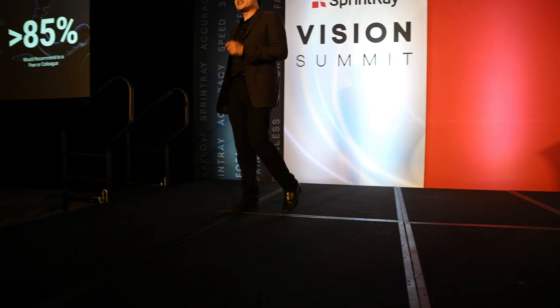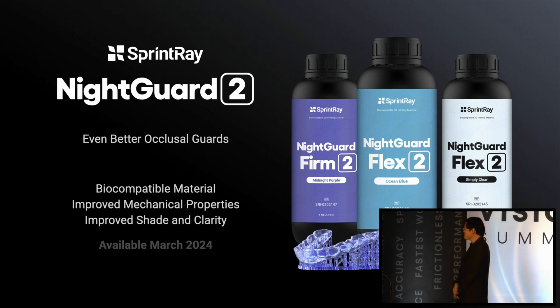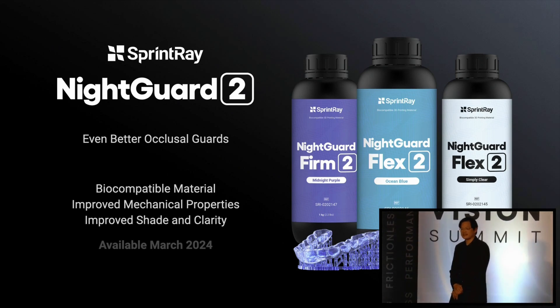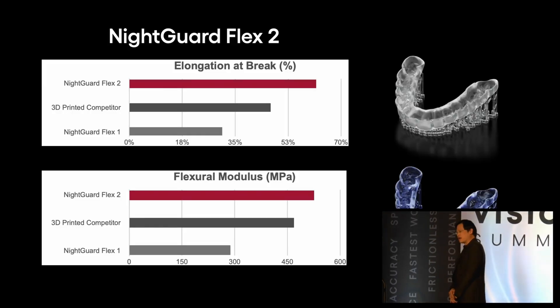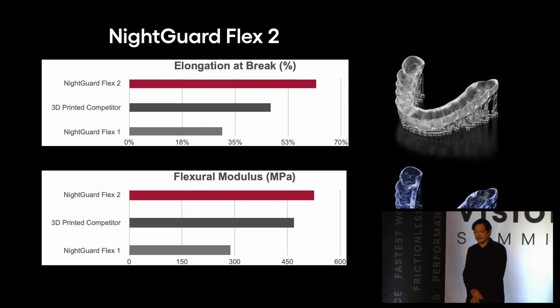The team at SprintRay cannot leave good enough alone because the aspiration is always to do better. Now we have a method of instantly designing your splints, printing faster than ever, and curing faster than ever. And on top of that, we have the optical polish tank — so even after you print it, you no longer need to sit there to coat it or to polish it. FlexSplint 2 will outperform FlexSplint 1, but for those of you that love FlexSplint 1, it will still be on the market.